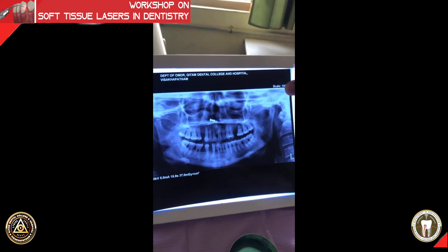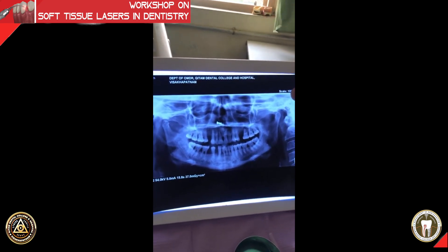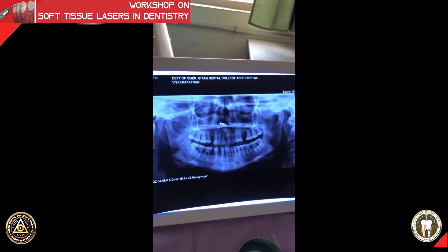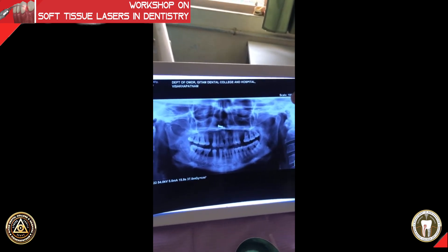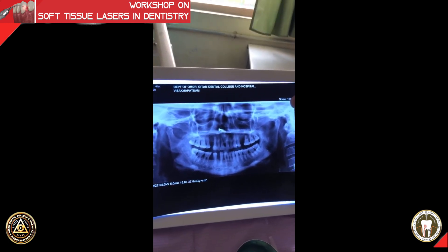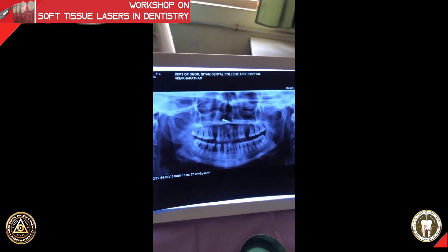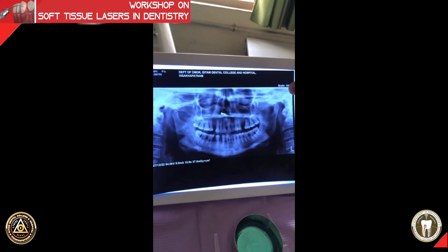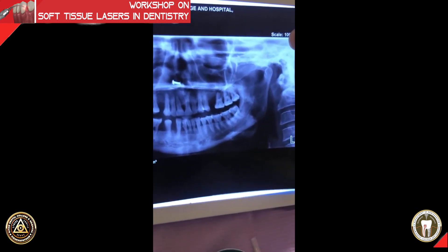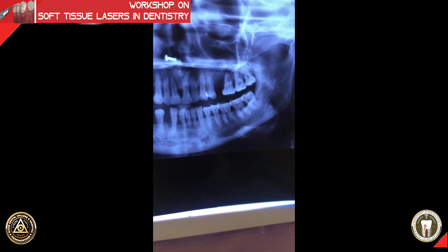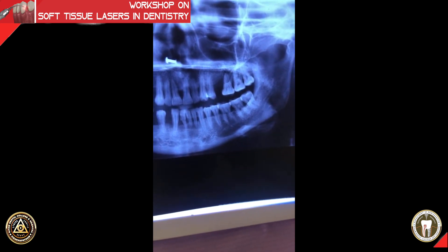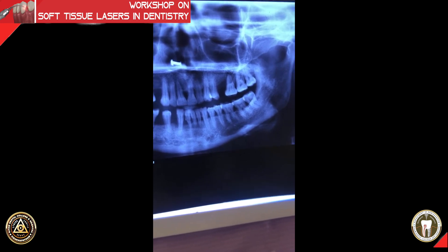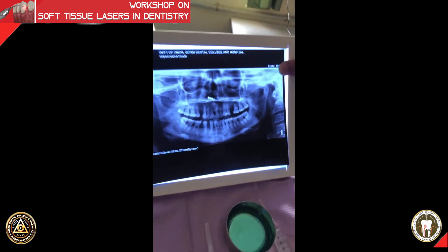We're going to show this in a patient with periodontitis for whom non-surgical therapy has already been completed. We are going to demonstrate in an area where there is horizontal bone loss. Photodynamic therapy is indicated as an adjunct to non-surgical periodontal therapy — meaning as an adjunct to scaling and root planing — when you have remaining pockets of around 5 mm with horizontal bone loss. If it doesn't resolve, you can go for surgical therapy. In the third quadrant, you have horizontal bone loss only around the cervical third, so you may not really need to open a flap. You can do photodynamic therapy and get the pocket under control. For furcation involvement you may need a flap, but for now we are going to do a demonstration in this third quadrant.